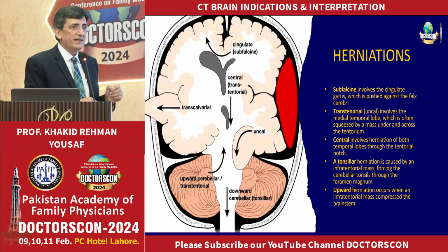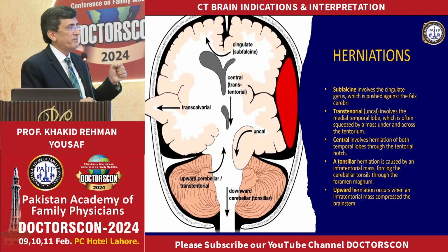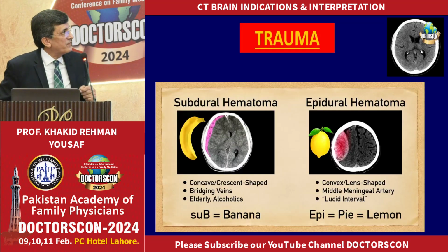This is the area where the anterior cerebral artery lies. If it is under pressure, it will bring about infarction of the splenium area. So it's very important to understand. This is a subdural hematoma, an acute hematoma, causing compression on the midline and the ipsilateral ventricle.